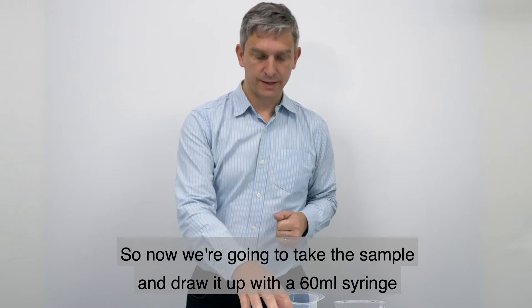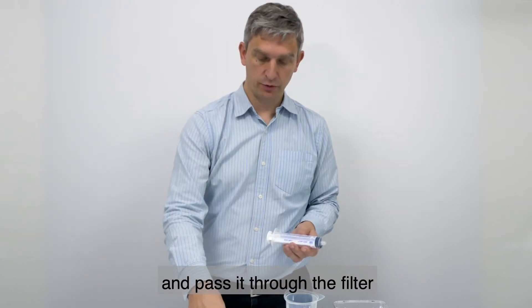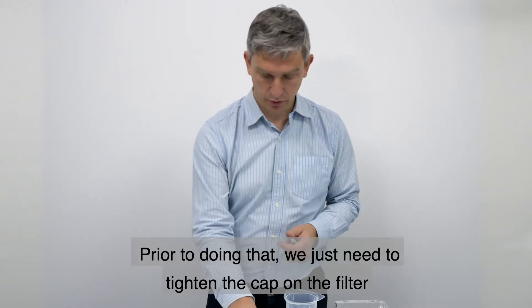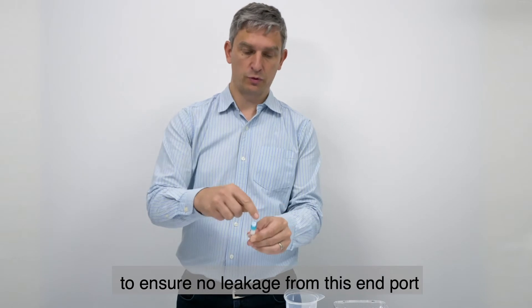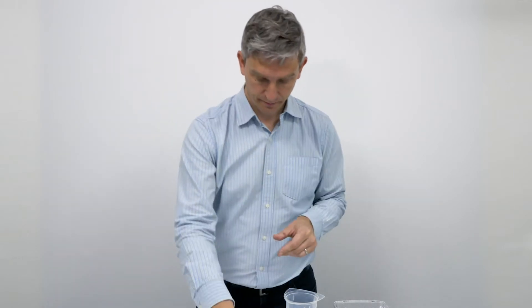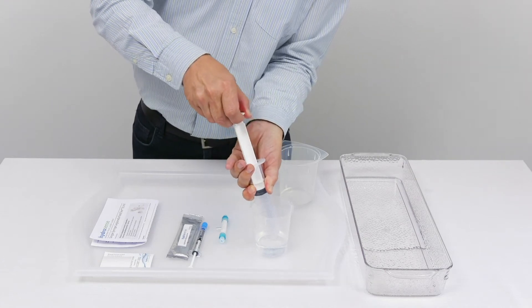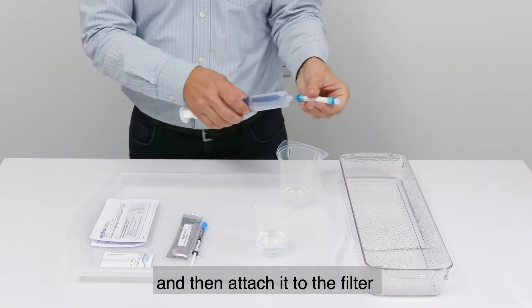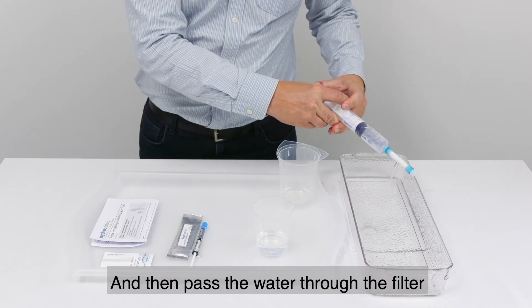Now we're going to take the sample, draw it up with a 60 millilitre syringe, and pass it through the filter. Prior to doing that, we just need to tighten the cap on the filter to ensure no leakage from the end port. Then we draw up the sample, attach it to the filter, and pass the water through the filter.